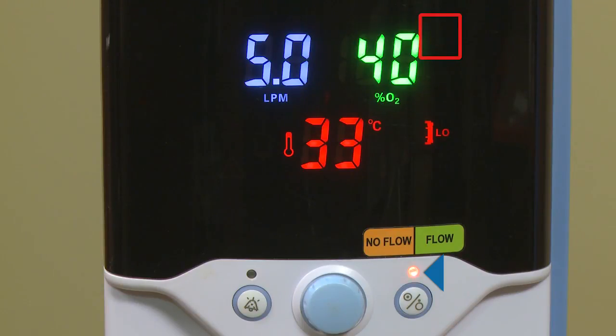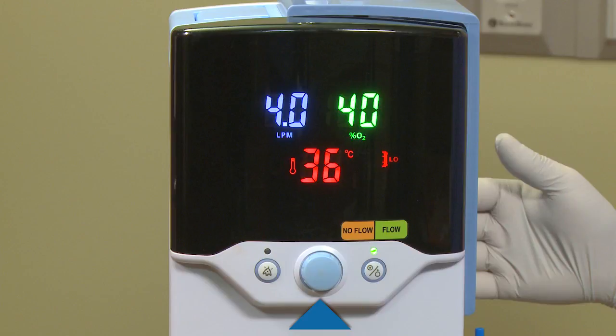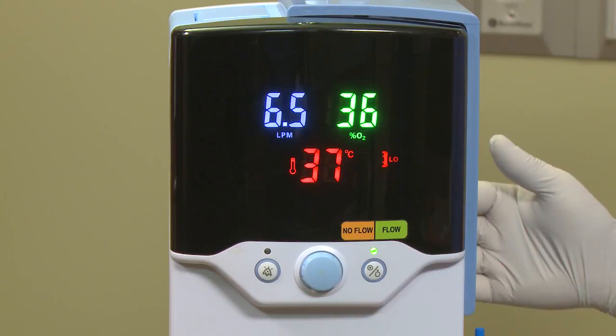The central blue setting control knob controls all three parameters on the display screen. The FiO2 is controlled by a built-in electronic blender, which allows for precise FiO2 delivery between 21 to 100%. The flow is controlled by an integrated electronic flow meter, allowing for accurate flow rates between 1 to 40 liters per minute. The temperature can be adjusted between 33 to 43 degrees Celsius. To adjust these parameters, simply push the center blue knob until the item you wish to adjust flashes, then turn the knob to your desired setting. Once the selected parameters have been set, simply stop pressing the button and the unit will lock in the settings.